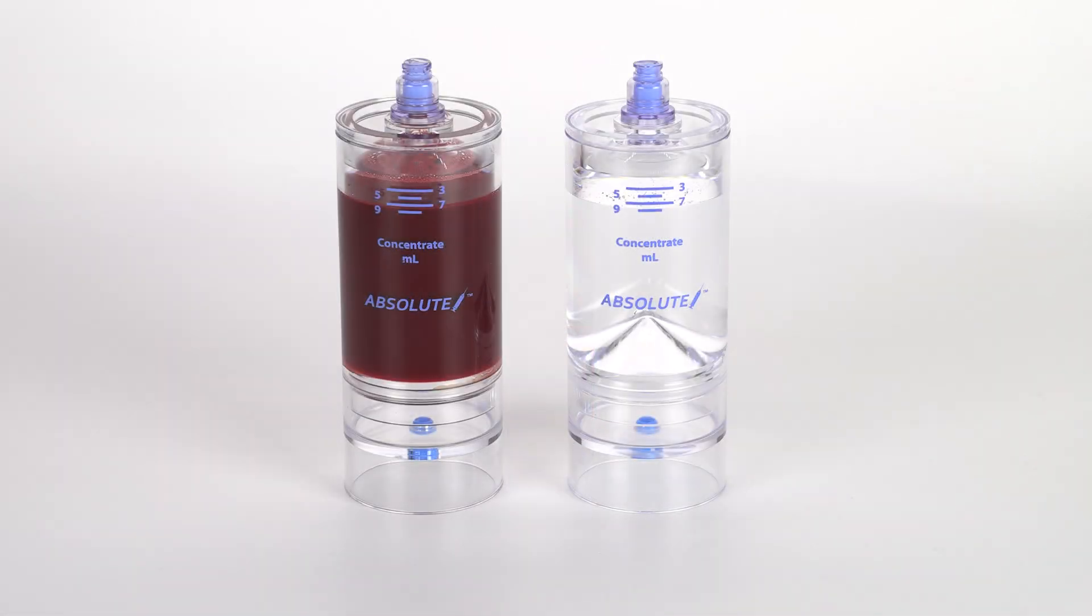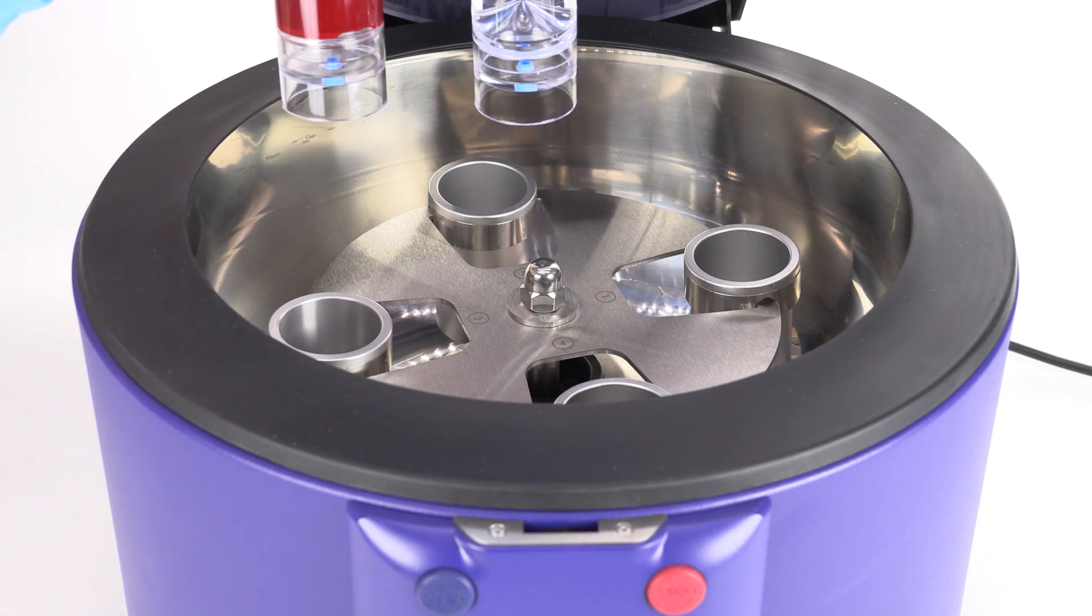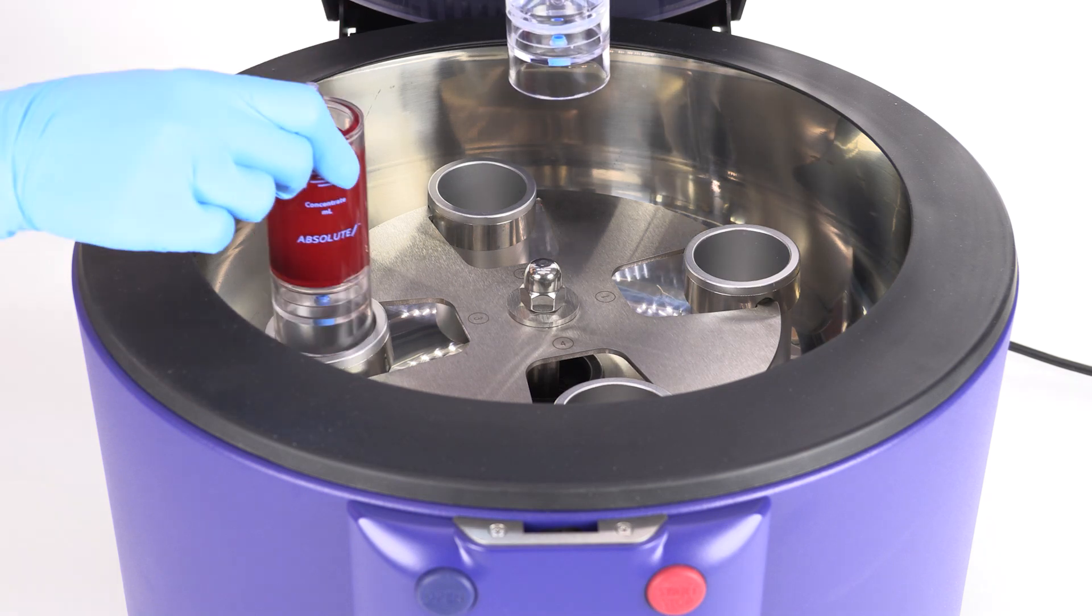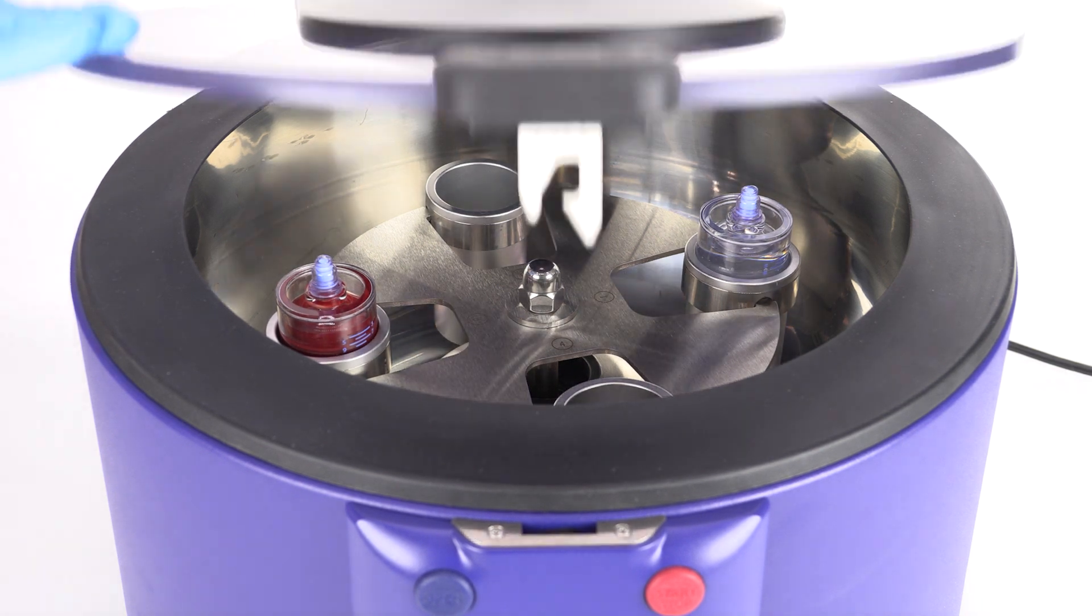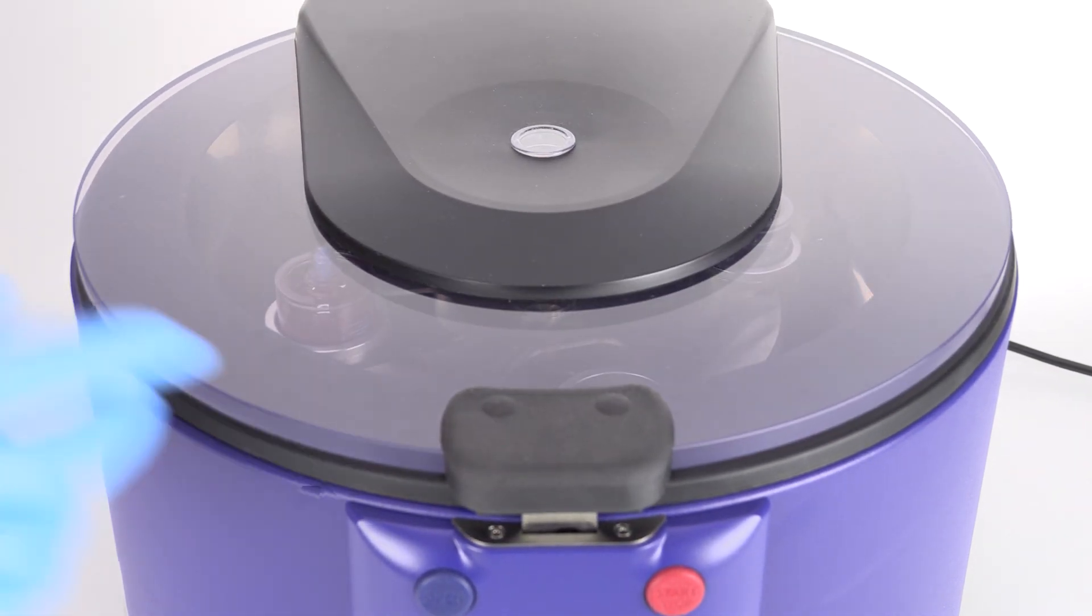Use the counterbalance device to counterbalance with equal volume. Place both devices in the centrifuge rotor at opposite ends. Follow the protocol settings provided in the Absolute PRP insert. Close the centrifuge lid and press start.